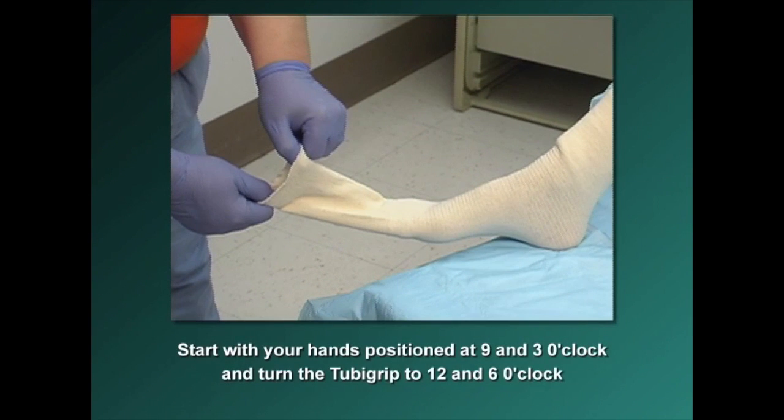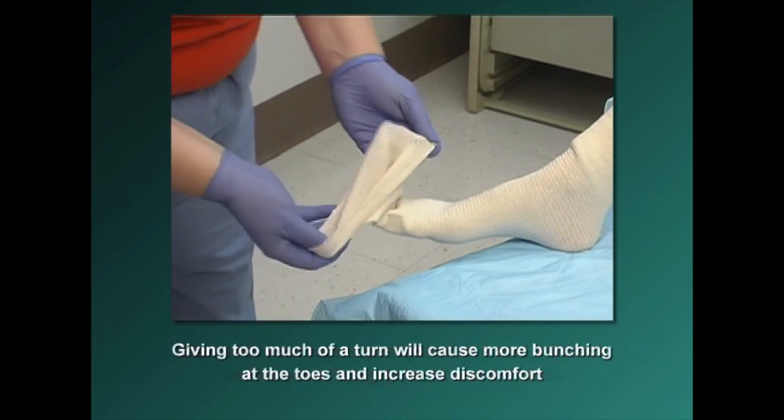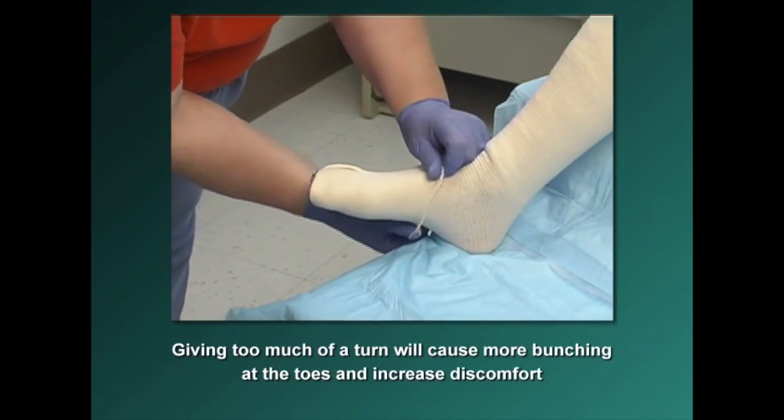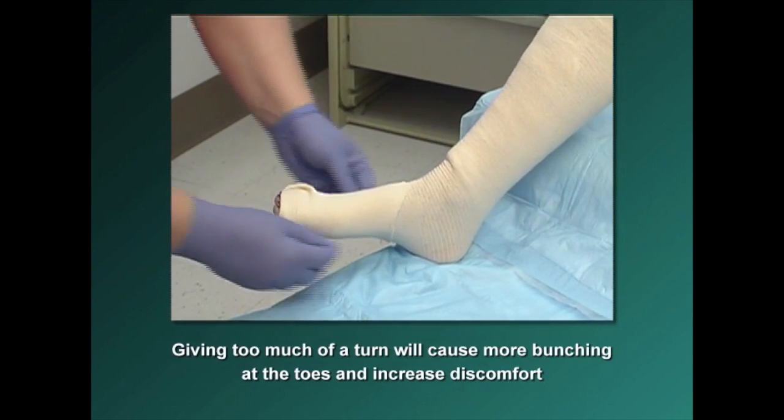To fold back the Tuba Grip at the toes, start with your hands positioned at 9 and 3 o'clock and turn the Tuba Grip to 12 and 6 o'clock. Giving too much of a turn will cause more bunching of the Tuba Grip at the toes and increase the patient's discomfort.